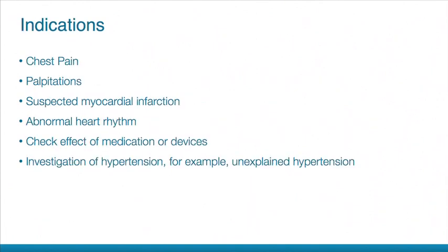Indications for electrocardiogram include chest pain, palpitations, suspected myocardial infarction, abnormal heart rhythm, to check the effects of medication or devices such as pacemakers, and investigation of hypertension, for example, unexplained hypertension.